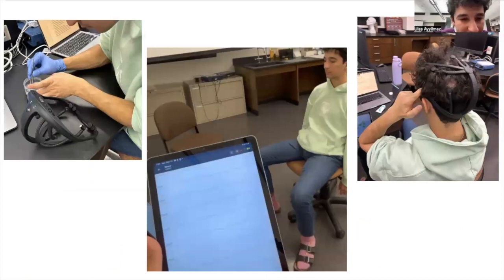Here you can see more of the experimental setup as well as the machine that we used. On the left, you can see how I'm using ionized water to clean the sponges and make sure that they conduct electricity, and I'm attaching the sponges to the headset. To the right, you can see the headset being placed on my head, and that headset has 7 different nodes attached to my scalp that conduct the electrical signals that my brain emits. And in the middle, you can see how each node collects information in a sinusoidal wave format, and that's the data that we gathered.